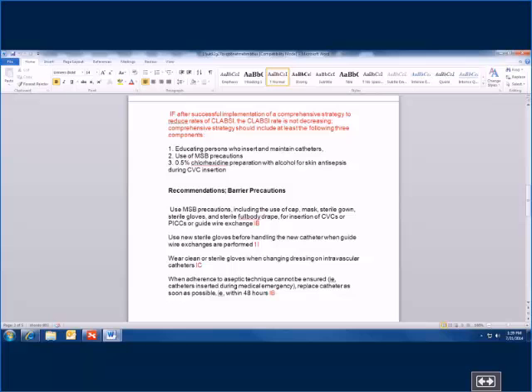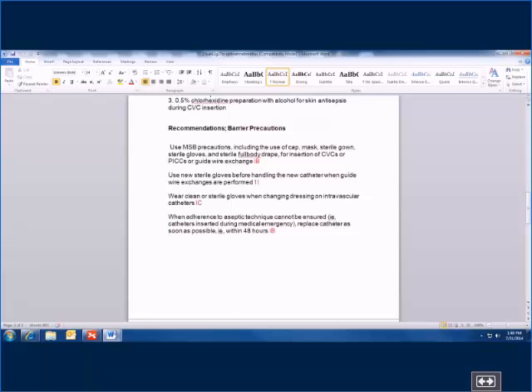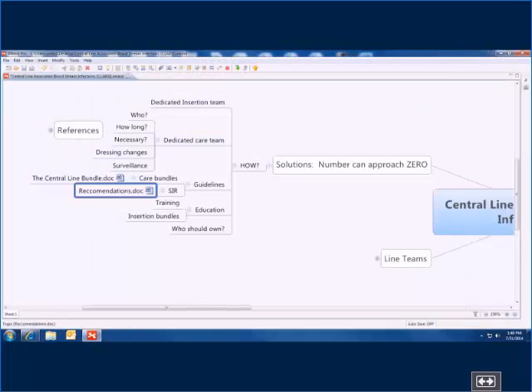They also recommend that if central lines are put in a crash or a code situation or a trauma, that you look at that line very carefully, and if there is consideration that the line was not put in with the best sterile technique, you should replace that in 48 hours. Now, nobody is advocating, that I have seen, the routine replacement of central venous catheters put in those situations. At my hospital, we instituted a program where all the central lines put in on the field would be replaced within 24 hours. And we found that that did not make any difference in the amount of central line infections we had. I think that is true because it boils down to most of the problems being associated with the care of the line and not the insertion of the line.